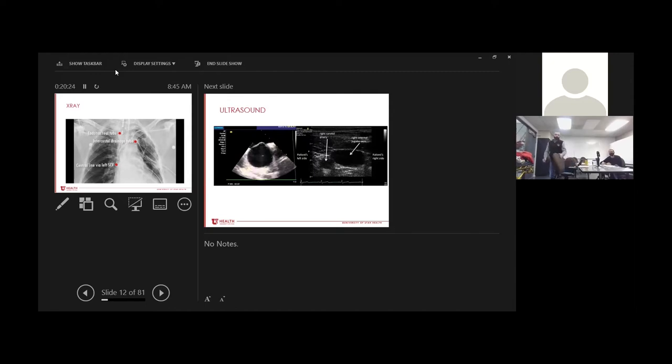X-ray is going to pick up the line going, can I ask you something? What you're saying is if we're short. Exactly, and that's because you need to make sure the X-ray is done and has been interpreted by someone who knows how. But I mean, X-ray skills are great. If you have them or you want to develop them, that's awesome. I'm not the guy to teach you, but there's plenty of people in this program who are really good at it and can help you with that. So that's going to show you placement. An X-ray is helpful, but an X-ray is slow.